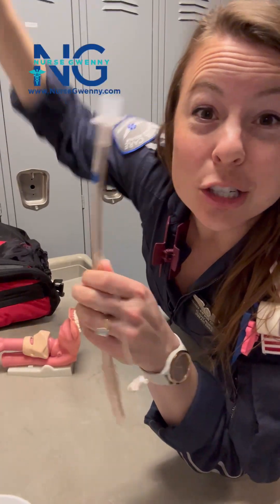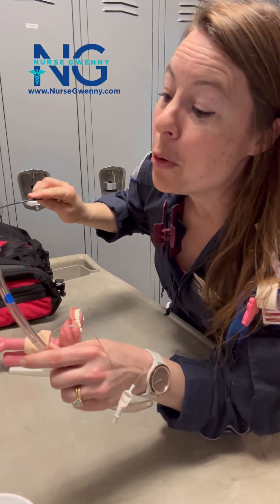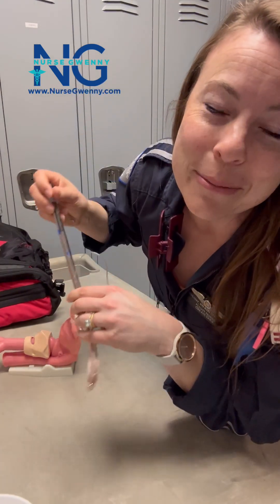Stop yanking your rigid stylet straight out of the endotracheal tube when you're intubating your patient with a rigid stylet. Let me show you why.